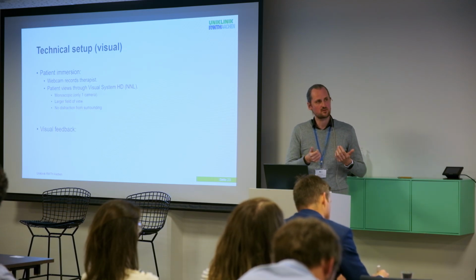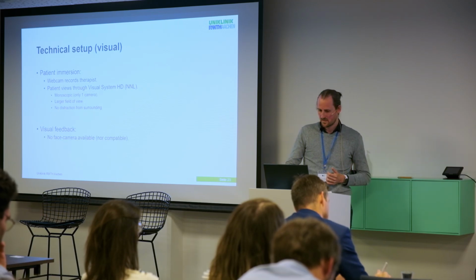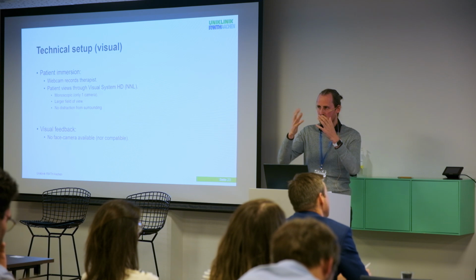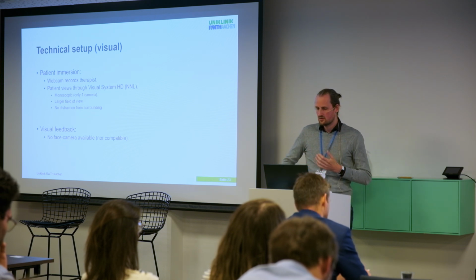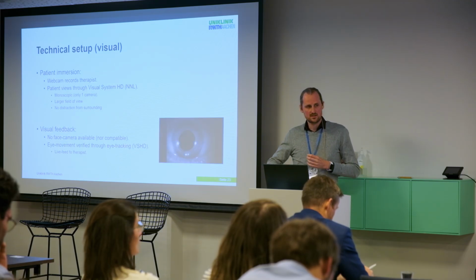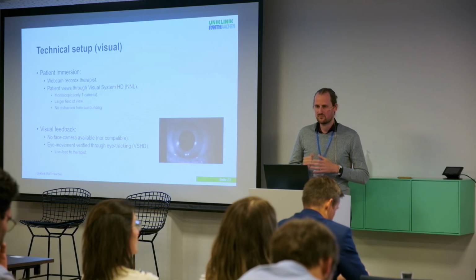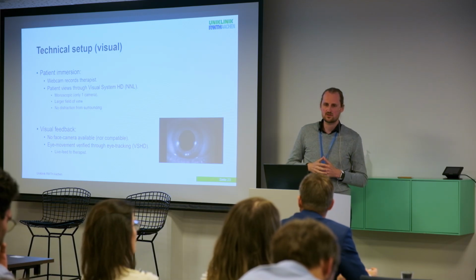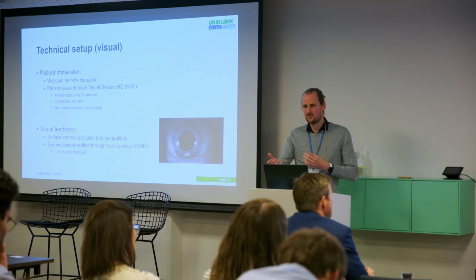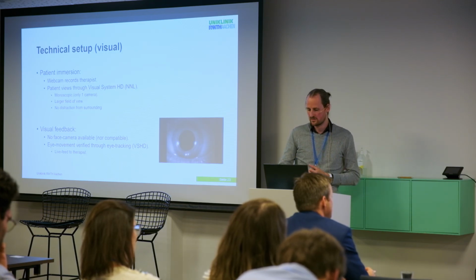Additionally, we can provide some visual feedback, not to the participant, but to the therapist. Unfortunately, we don't have any face cameras available to record the entire face of the participant, nor would this be very effective when you're wearing a goggle system. What we did have was an eye camera. So we did not perform any advanced eye tracking, but we simply verified the eye movement, especially during the EMDR treatment, by giving a live feed of the participant's eye to the therapist performing the therapy.